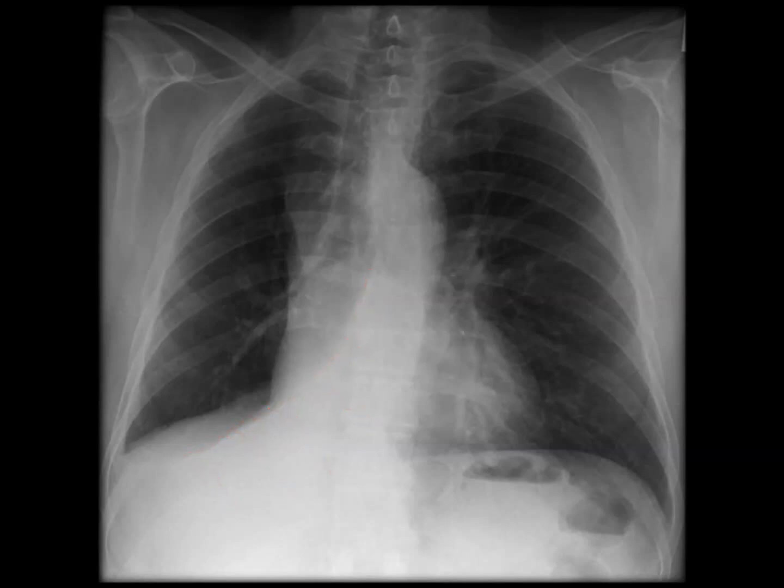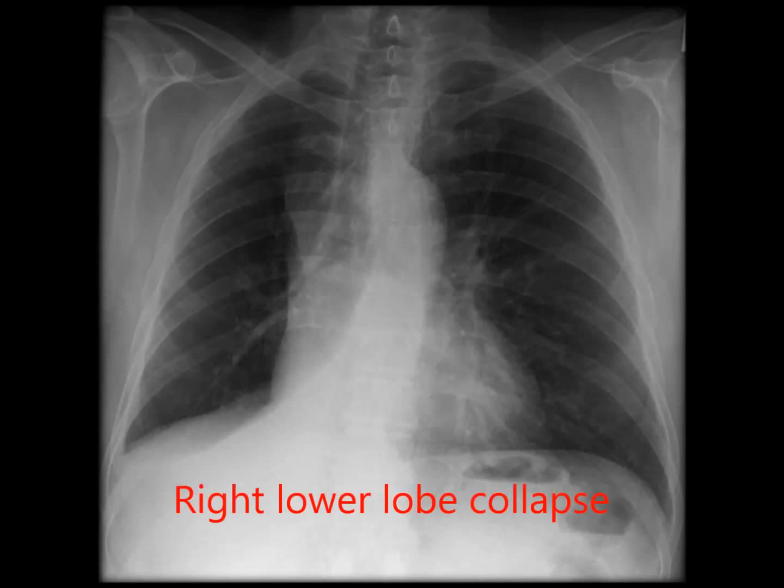Putting all this information together: the silhouette sign at the right hemidiaphragm suggests a right lower lobe problem. The asymmetry of the lungs and right-sided deviation of the trachea and mediastinal structures suggests a reduction in right lung volume. Add to this the area of opacification with absent lung markings, and you have a classic picture of a right lower lobe collapse.